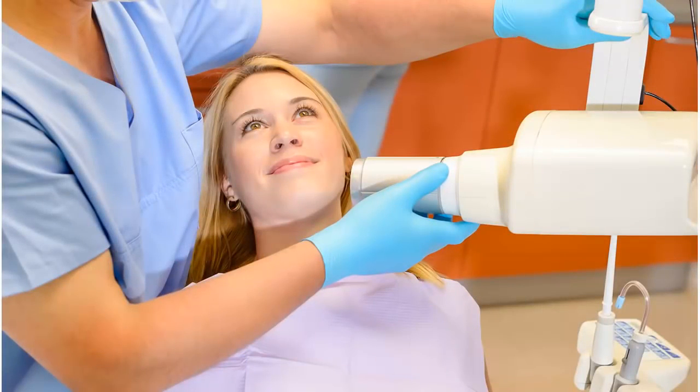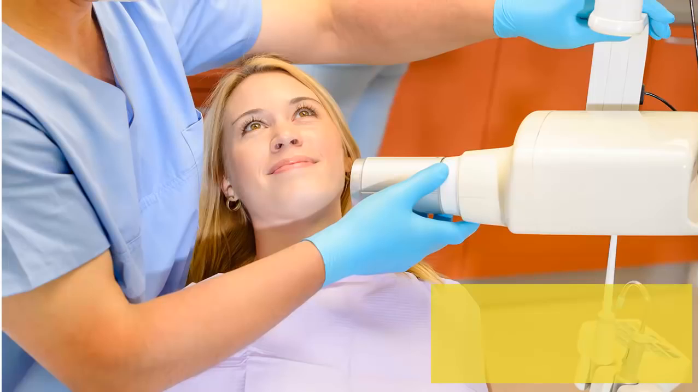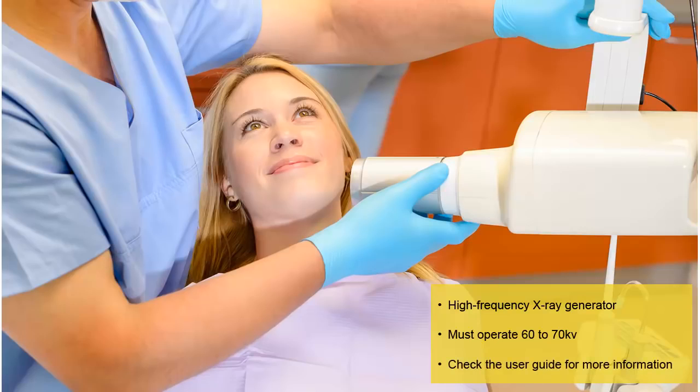The RVG sensor is compatible with all x-ray generators that meet the current standards of intraoral radiology. A high-frequency x-ray generator is recommended so that the patient is exposed to a lower dose of radiation. The x-ray generator must operate with a voltage of 60 to 70 kV; the RVG sensor is not compatible with generators that have a voltage less than 60 kV. The user guide provides a table of suggested exposure times for an x-ray generator output of 70 kV and 7 mA. These are suggested exposure times only, as exposure times vary by type and age of the generator.